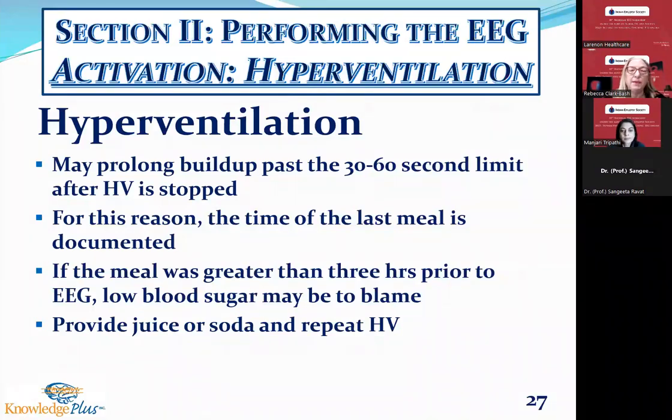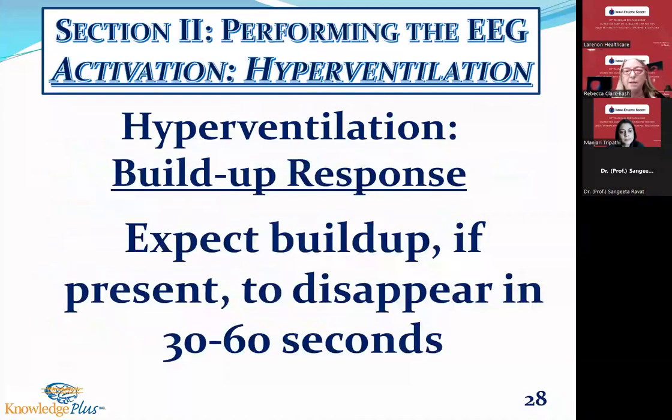Now, it's important when you come upon prolonged buildup to give your neurologist, or whoever's reading the study, a heads up. Say, 30 minutes into the recording, they had prolonged buildup. It's easy to miss something like that, especially if your neuro is reading a dozen EEGs a day. So again, it should disappear. That buildup response should disappear after a minute.